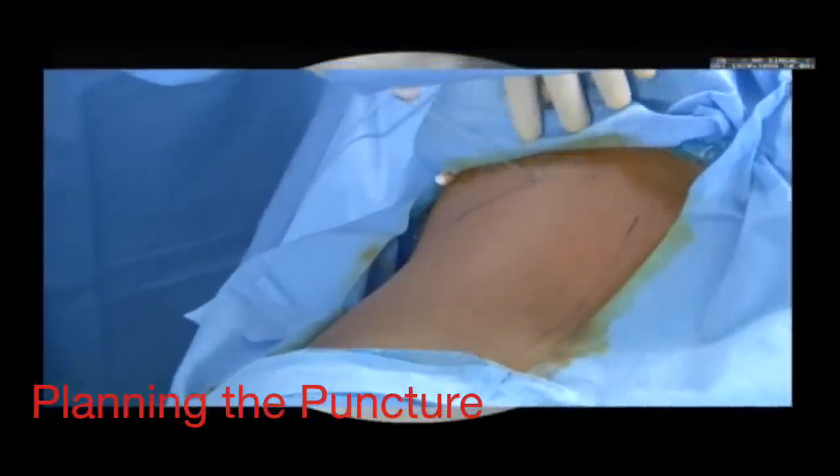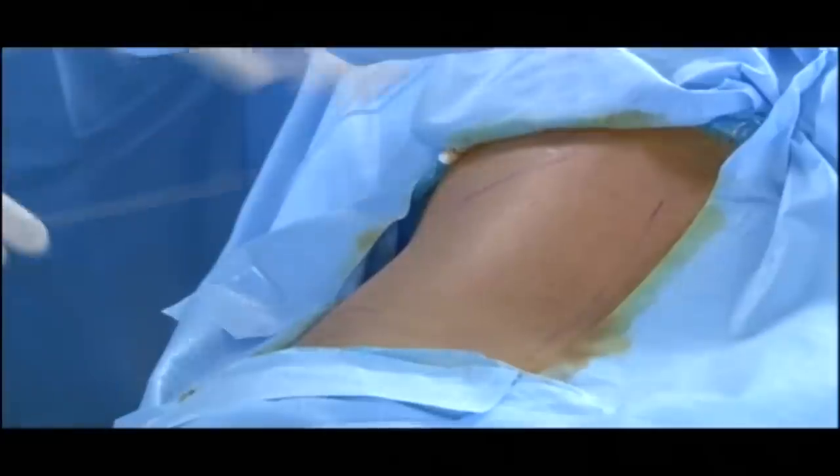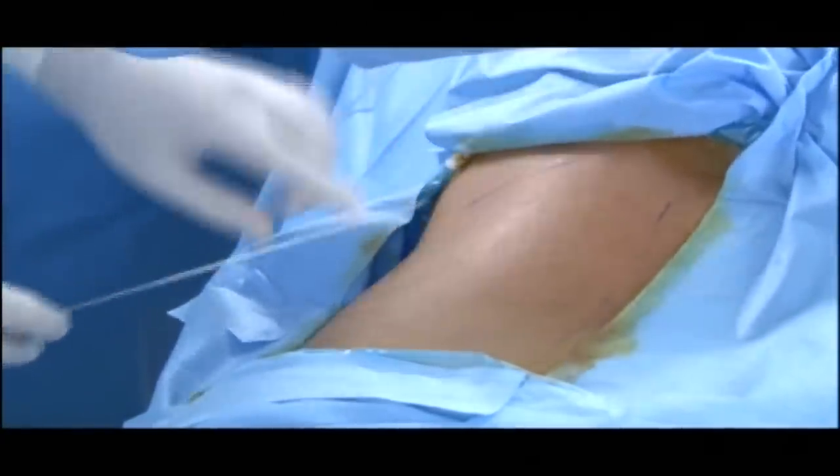Yes, Dr. Kukreja, we are watching you. This is the 12th rib, this is the iliac crest, and this is the midline. Here is the posterior axillary line and I am going to go just below the 12th rib in the posterior axillary line. Can I have the fluoro, please? The fluoro C-arm is in 0 degree.